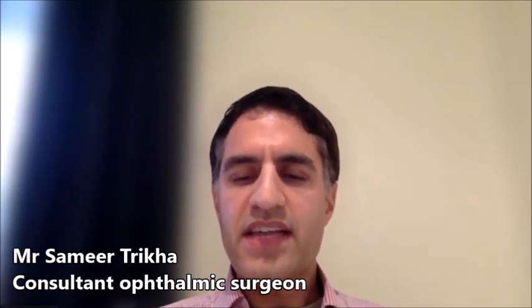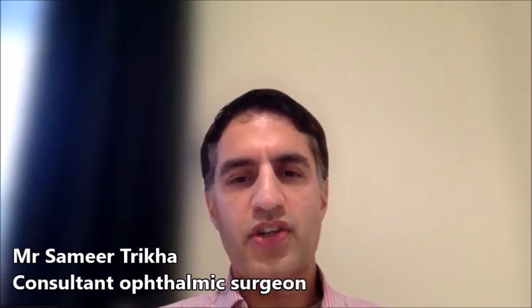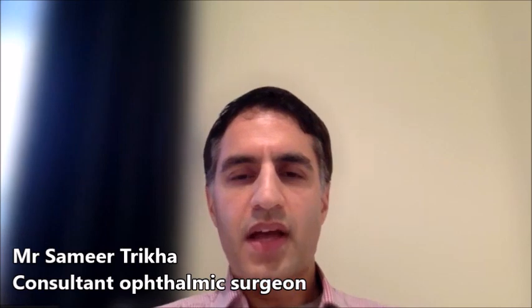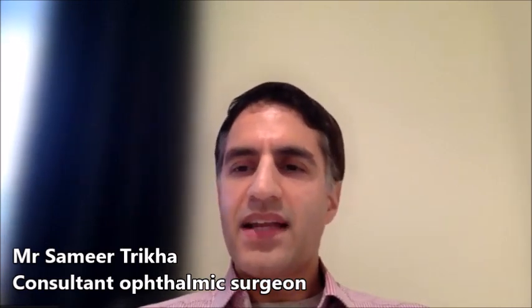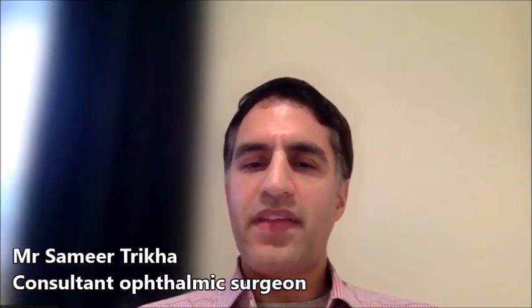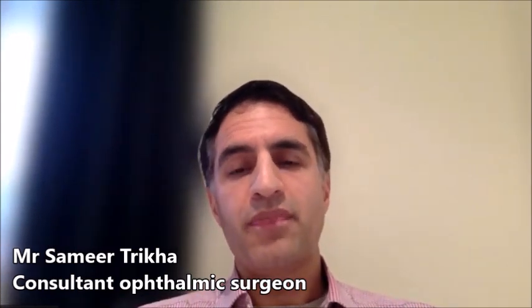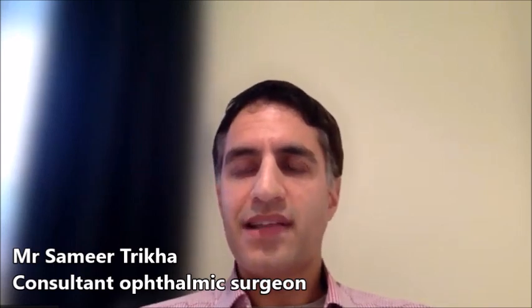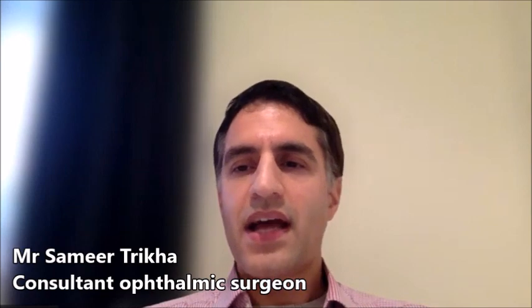So generally, the lenses are very safe, but do consult very carefully with me in terms of the type of lens you may wish to choose. A final point to mention is something called astigmatism. And astigmatism is whereby the natural lens of the eye, or should I say the eye, is shaped a little bit like a rugby ball. And of course, the benefit of these personalized lenses is they can be corrected for astigmatism as well as near and long sight.